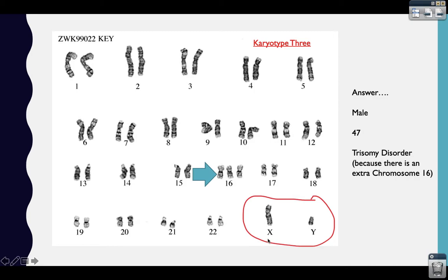Karyotype 3: this person is a male, because there is a chromosome over the X position and a chromosome over the Y position. This person has 47 total chromosomes, because as indicated by the arrow, at position 16 the person has an extra chromosome — meaning there are 3 chromosomes at position 16. If you have one extra chromosome, or 3 at one position, it's called a trisomy — specifically trisomy 16. Some trisomy disorders have a name; for example, a third chromosome at position 21 would be called trisomy 21, or Down syndrome.